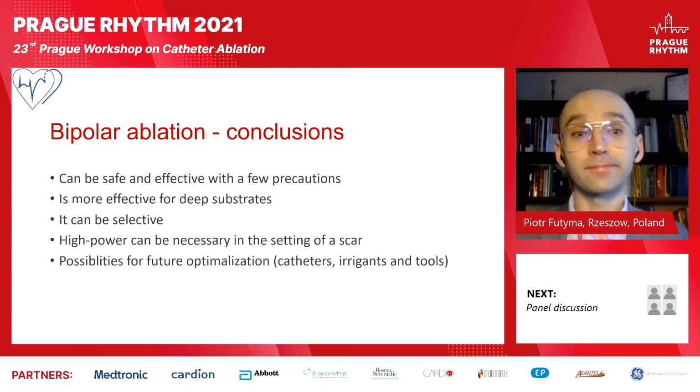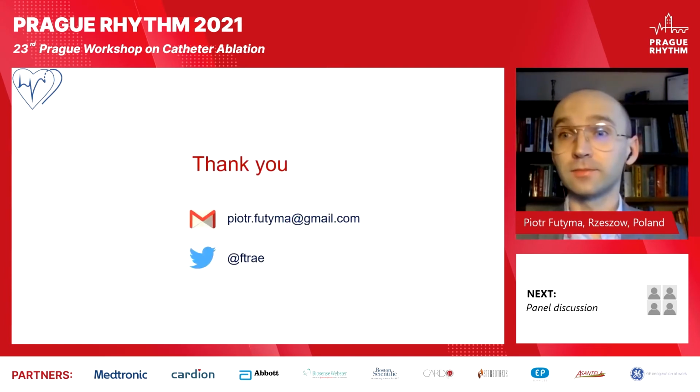And there are many possibilities for future optimization of our setup. We can use different catheters, different coolants, and probably in the future we will be able to use more advanced bipolar ablation tools. So thank you for your attention.